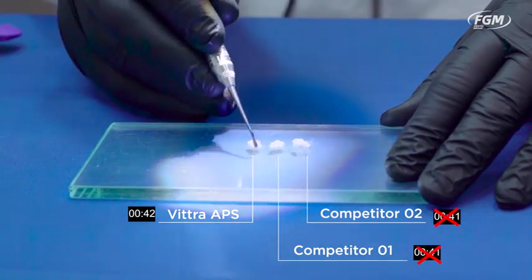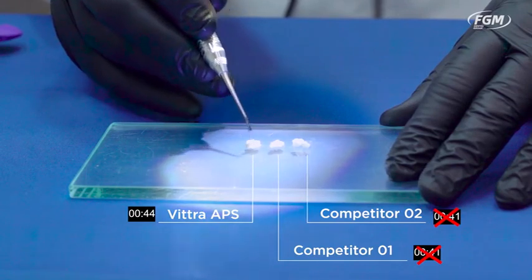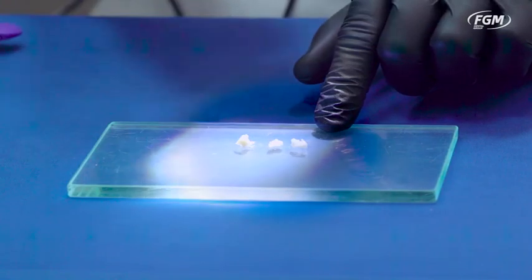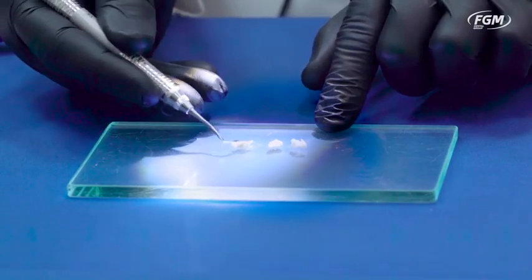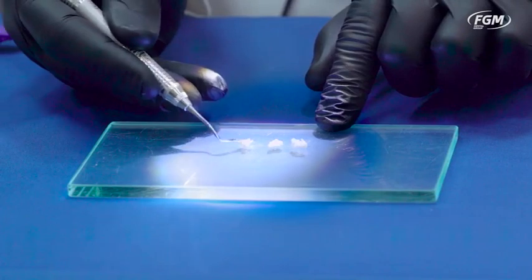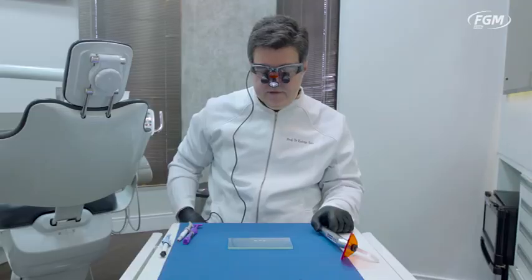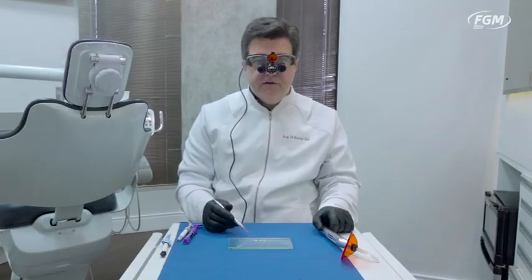It's gone — the other composite is gone, as you can see. Vitra is fairly plastic. This one is gone. Vitra — it's still possible to work with it. What you may conclude from this is that even under extreme light, Vitra APS has quite a longer working time than traditional composites that solely depend on camphorquinone as a photo-initiator.